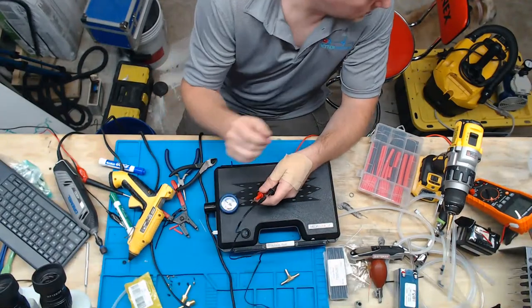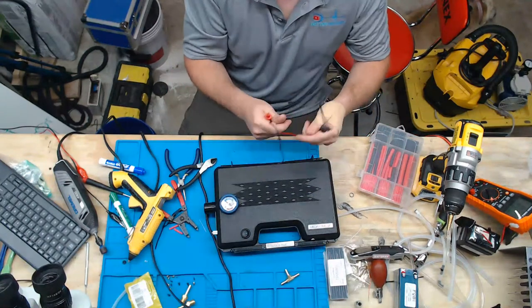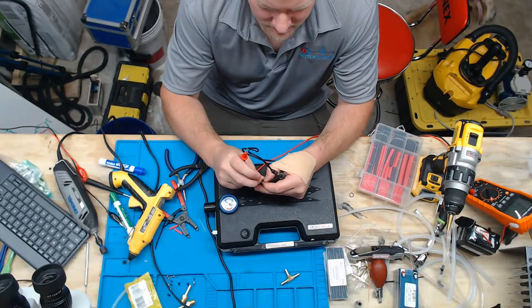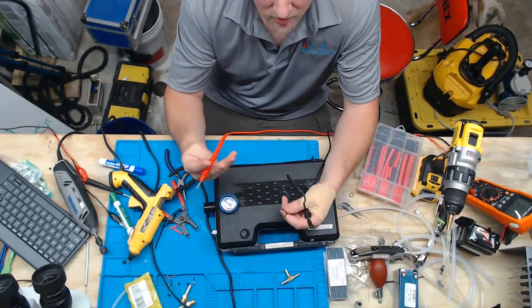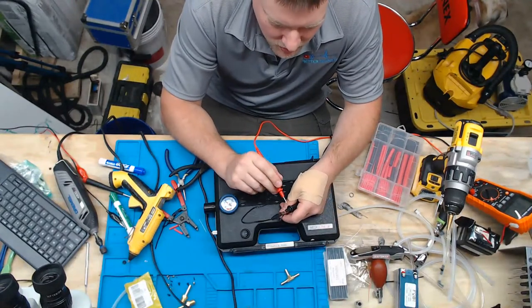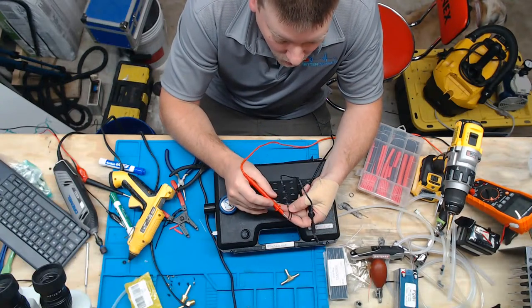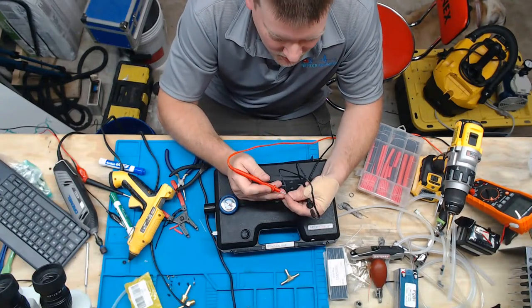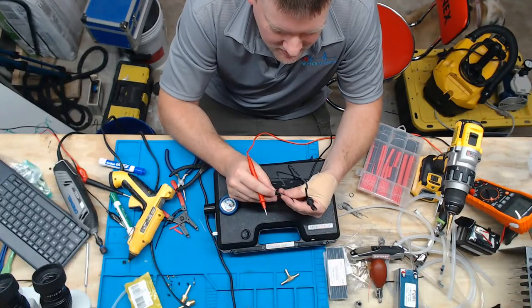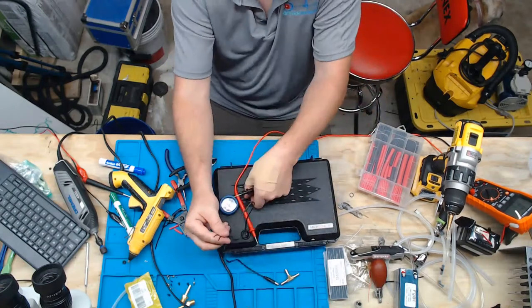Let's see. My meter's still on. So if you guys ever do splices on these barrel connectors, just remember, always do a continuity check on what your positive pole is, which is your center pole. Sometimes it's the white stripes, sometimes it's not, so don't always rely on that. There we go. Yeah, this time it is the white stripes. I've seen that different though.